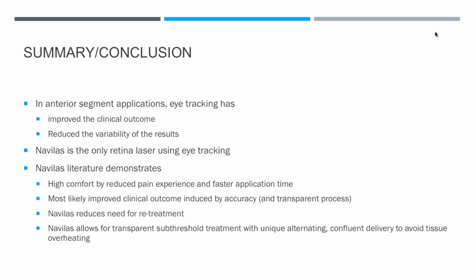Then navigated laser photocoagulation in the retina has revolutionized the approach of how we can perform retinal photocoagulation, and with the possible import of all the images and imaging modalities, we can now perform much more accurate treatments. We can reduce the need for retreatment.